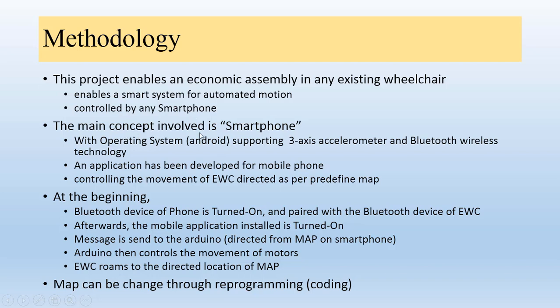The main concept involved is a smartphone which has Android based operating system which support the 3-axis accelerometer and Bluetooth wireless technology. We develop an application for that mobile phone which is used for controlling the movement of this electric wheelchair directed as per predefined map.